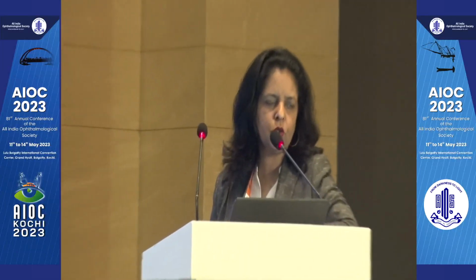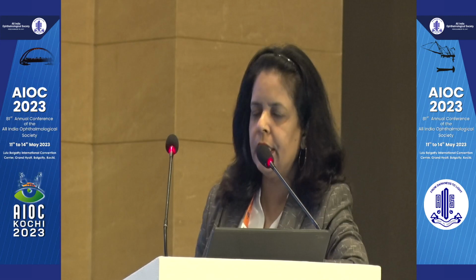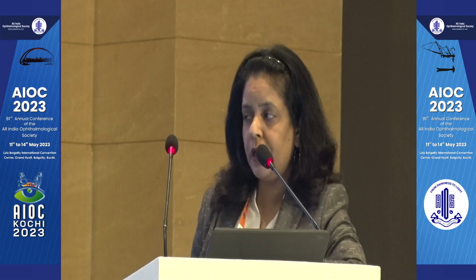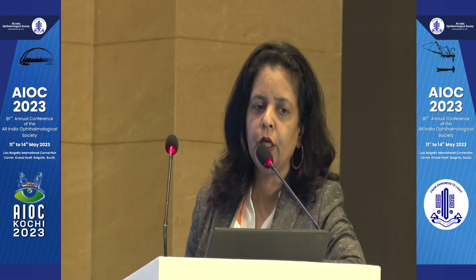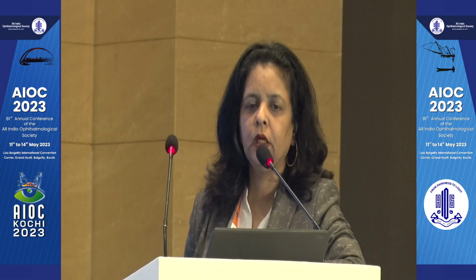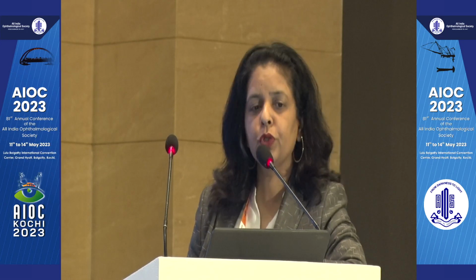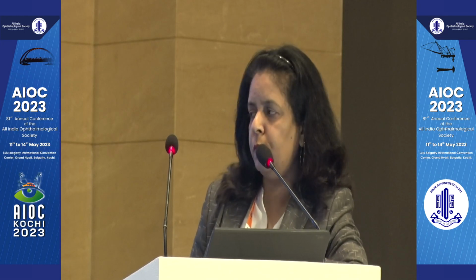So even if there are early lenticular changes, we would advise a cataract surgery with one of the presbyopia correcting lenses, and it is better not to go for Presby LASIK. But if it's absolutely a clear lens, then it's best to go for Presby LASIK. And when we go for Presby LASIK, as you already said, there is a concept of dysfunctional lens syndrome, and if we have access to EyeTrace, it is best to actually see how your lens is functioning and see whether Presby LASIK will work or not. But if you don't have access to EyeTrace, another thing that we do is measure the aberrations and check how the aberrations are, because again this will affect the post-operative result, so these two things become important for assessment.